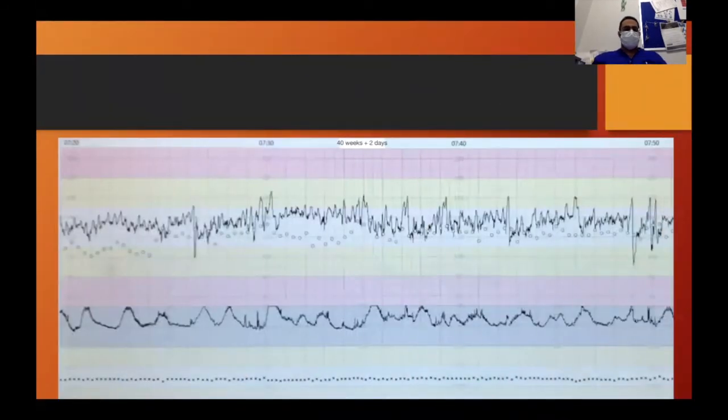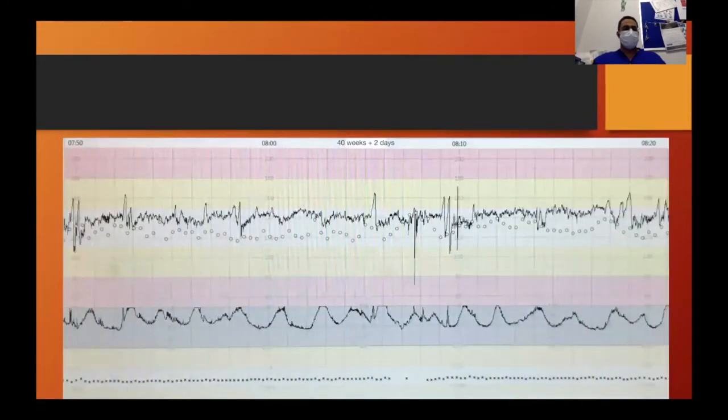Okay, and we're back to the variable cord compressions, even though I'm still saying contractions may be a little bit too frequent for this baby. The next question is: is this baby's baseline stable enough for me to carry on, or is this baby showing any other signs that it's unhappy? So Stan is not alarming, which is a good reassuring sign. Physiology-wise, there's a slight rise in baseline. She's also becoming slightly tachycardic, if you've noticed, so that may be going towards possibly infection.